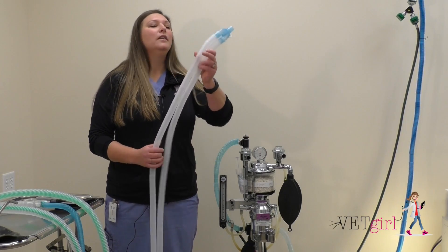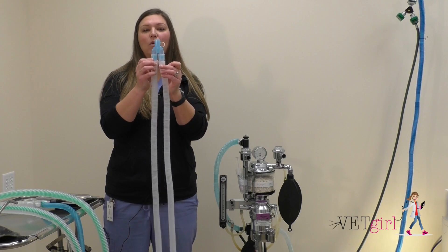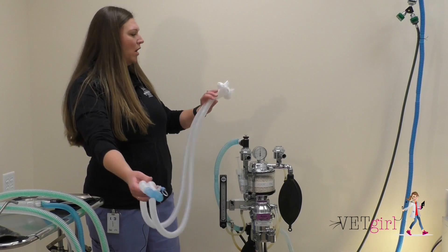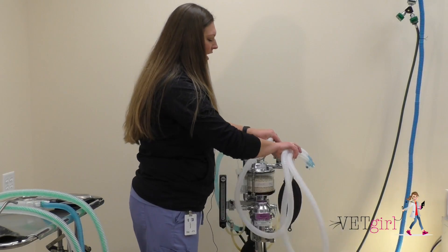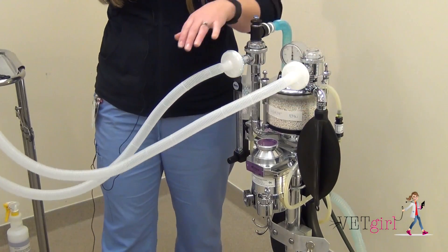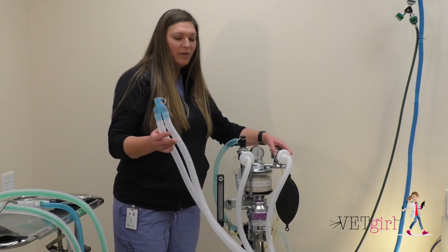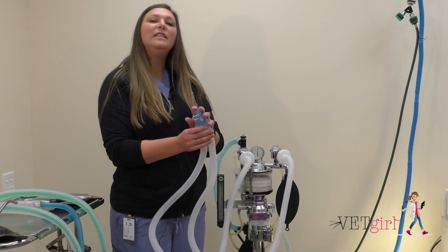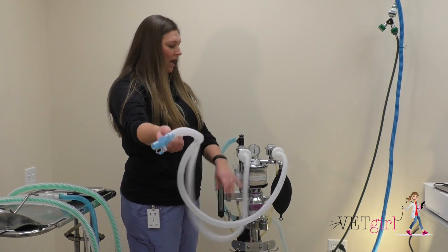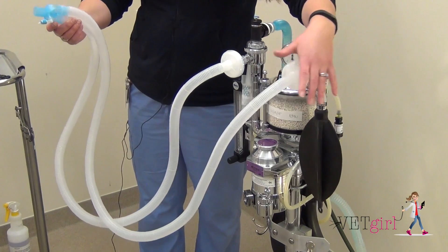The first re-breathing system I have here is called a Y-piece. You can remember this because of this simple system at the top which looks like a Y. This is connected to our patient and we have two breathing tubes coming off of it. One of them is going to go to our inspiration valve or inhalation valve, and the other one is going to go to our exhalation valve. This is hooked up to our patient at their endotracheal tube. Fresh gas and oxygen are delivered through the inhalation tube up to our patient. They take a breath and exhale, and the flow of oxygen and fresh gas pushes it up our exhalation valve, into the flutter valve, down into our sodalime canister to be reabsorbed, and then back to our patient.